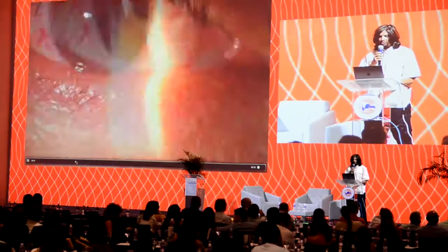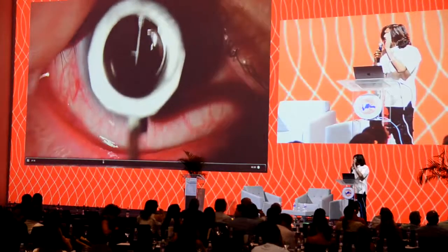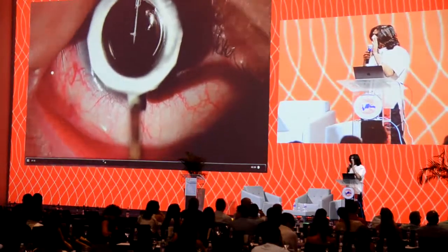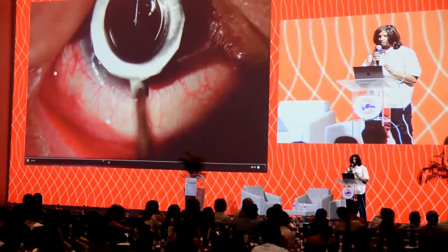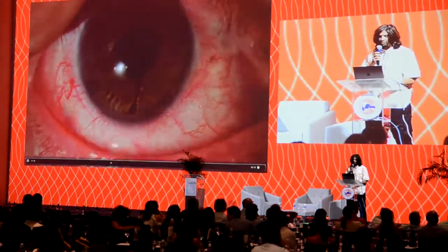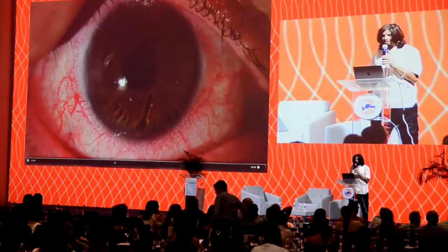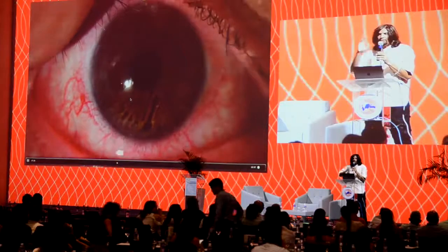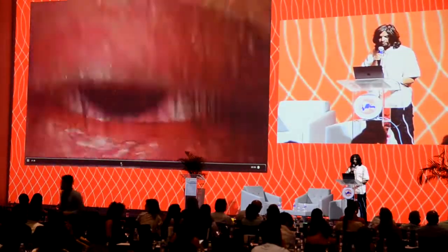At the slit lamp, we ask the patient to look straight ahead. Eyes open and push down. We push for about 3-4 seconds with no ink, and again, this is all we need to do to get a good mark on the cornea. There you see the marks on the cornea. So this patient has to have an arcuate probably around 80 degrees or so, and because the patient's sitting up, we don't need to worry about cyclotorsion.